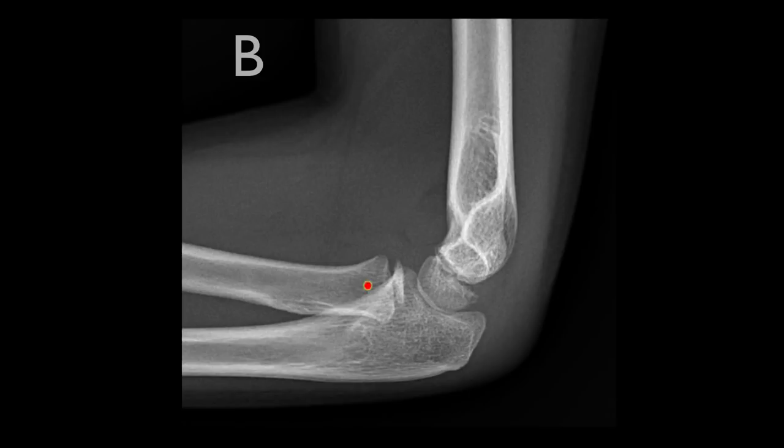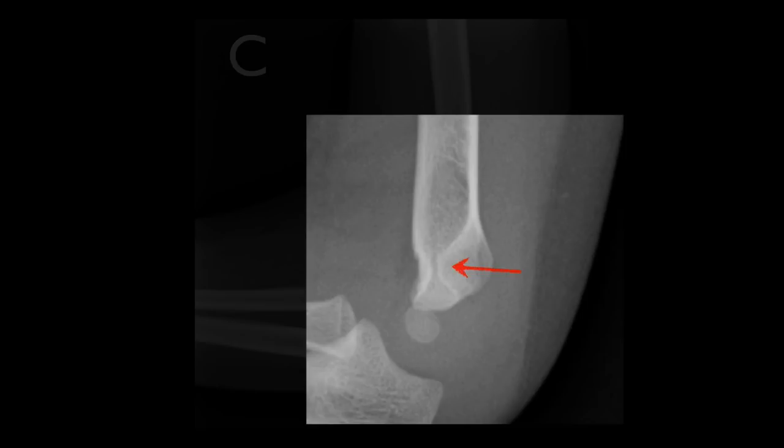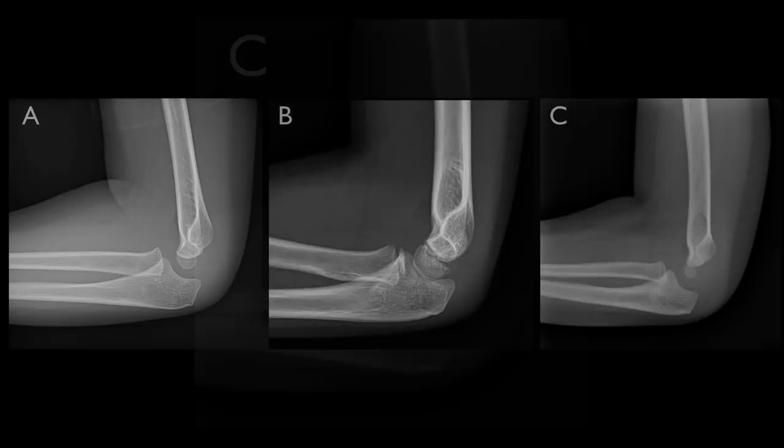Let's move on to case C. Again we can draw in the anterior humeral line and the expected location of the capitellum. Force down the radius has caused posterior displacement of the capitellum. On this occasion there is no evidence of an elbow effusion, but if you look carefully in the olecranon fossa there is irregularity of the cortex caused by the supracondylar fracture.